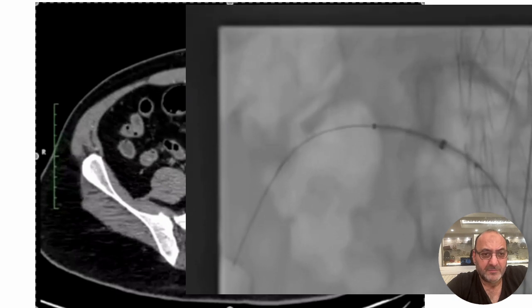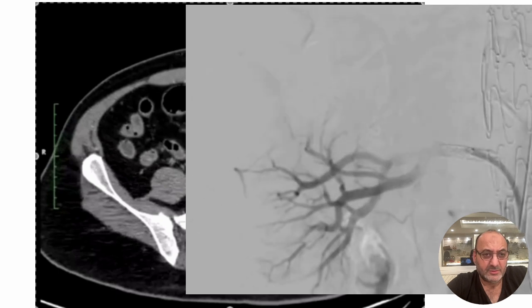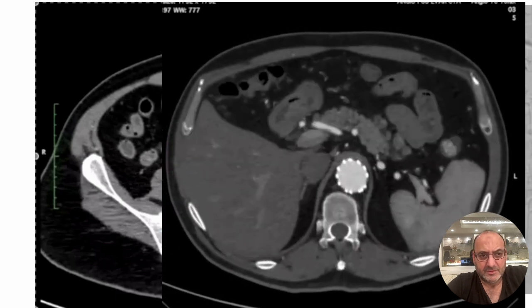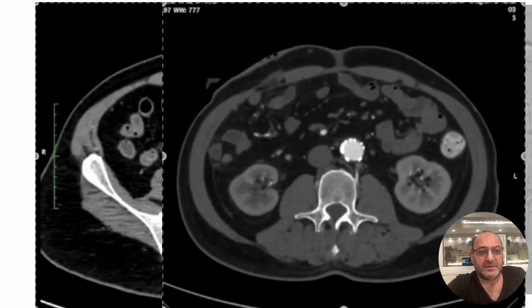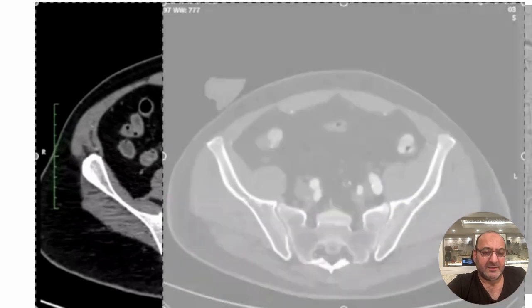Again, it's pretty nice. Already we ballooned. Already the aorta was ballooned. And if you look at the follow-up CT again, it looks incredible. I mean, it's hard to argue against that, but again, it's not without risks. And when Dr. Lombardi says that there is a 97% freedom from aortic-related mortality, that's also, without doing this, that also has a lot of merits as well.